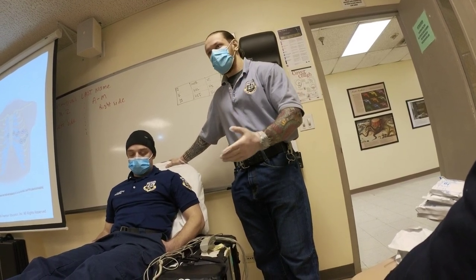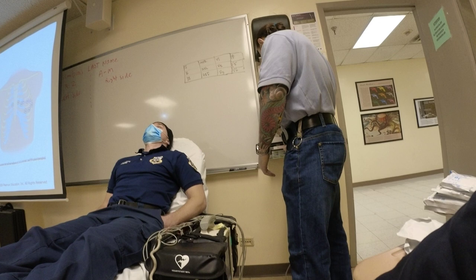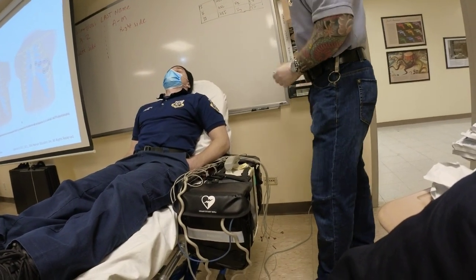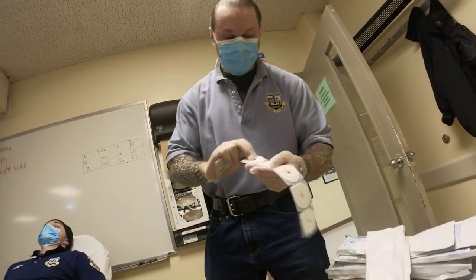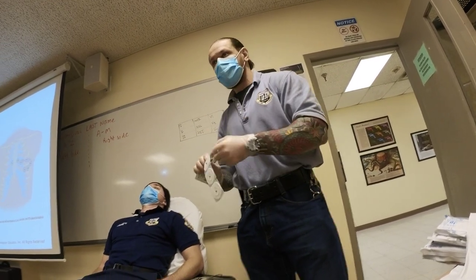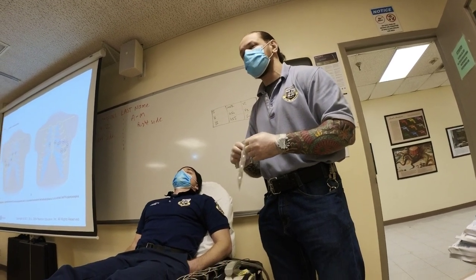Make sense? So I make him comfortable in the ambulance. I'll turn on the heat, put a pillow for him, so he's comfortable, he's sitting. I'll take alcohol to prep his skin. Usually you'll see some electrodes, which these are not. If you open them up on certain places when you do rotations, they'll have an abrasion pad, like it's blue. It's there to abrade the skin. Why do you need to abrade the skin? Good skin prep will give you a better tracing. You're not going to get all this interference, all this artifact.